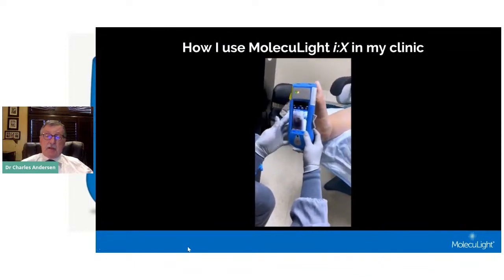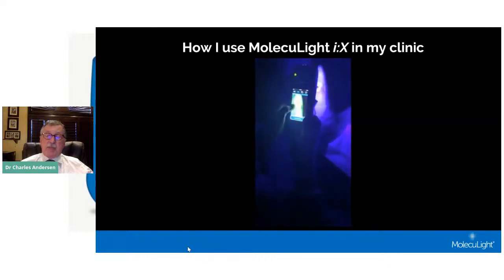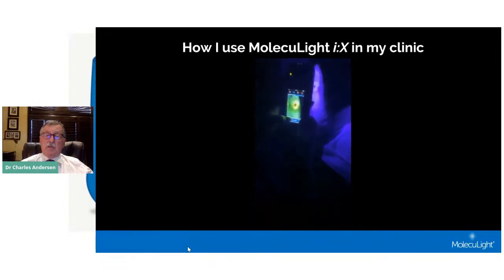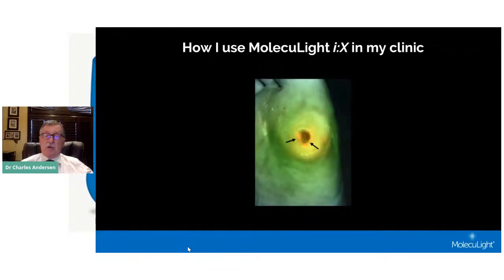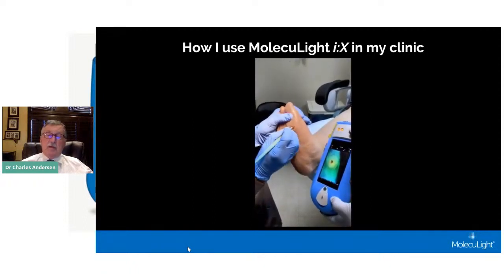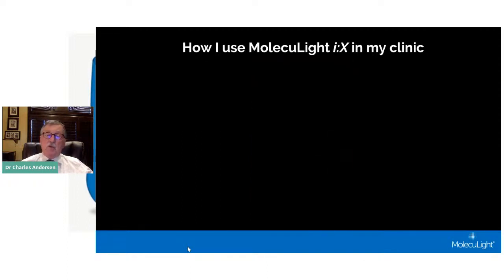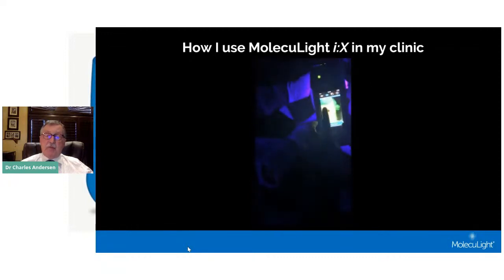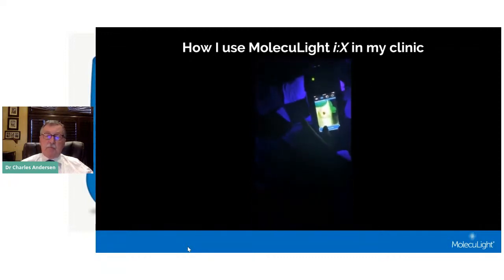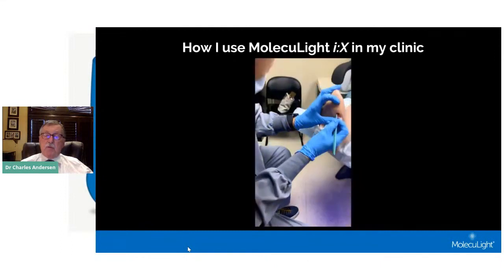So here we are in the clinic. We're obtaining our initial image. Then when you're doing the fluorescent part of the study, that is the actual bacteria, the lights are off and you're able to then scan that wound. And what we saw in the scan was that there was bacteria. What I'm doing now is using that information that we obtained with the scan, and I'm performing a curette type of debridement.